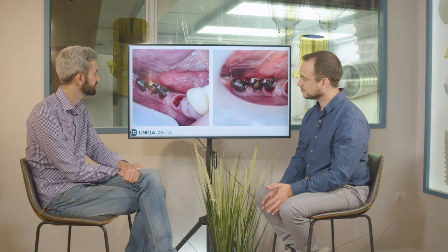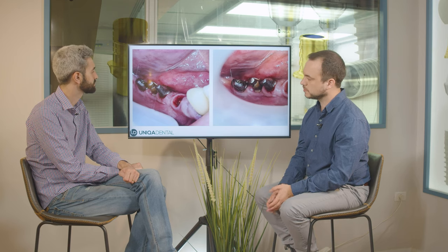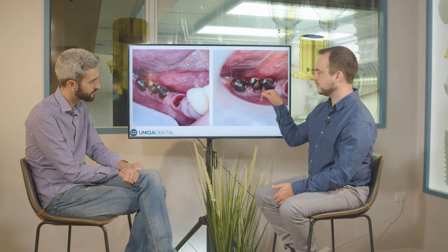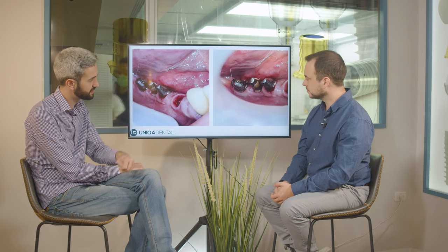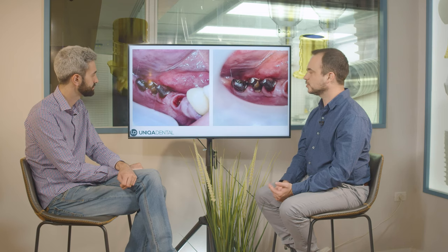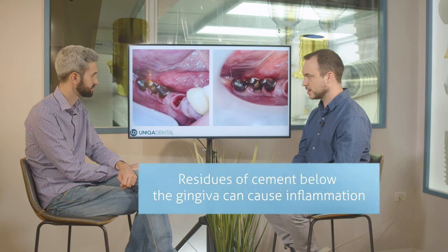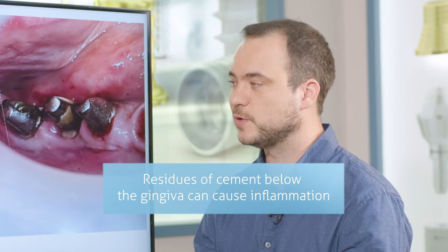Here you can see the abutments that were beneath the bridge. You can see in this abutment residues of cement that were below the gingiva — that's why the gingiva is a little pinkish-red. You don't want to have a lot of cement below the gingiva because it can cause a lot of inflammation, and if it causes inflammation, you can have a problem with the implants.